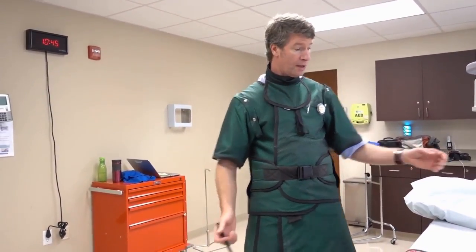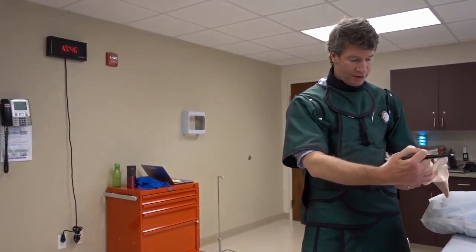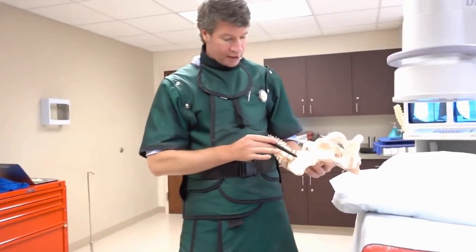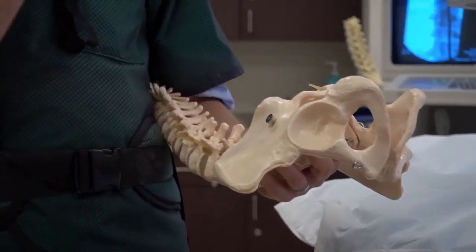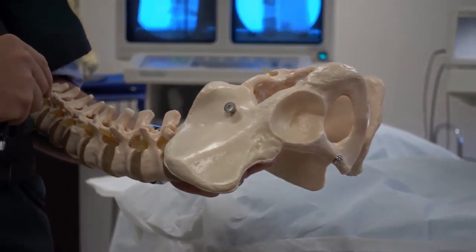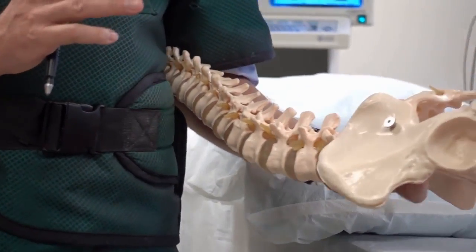Transforaminal just literally means through the foramen. The foramen is the hole on the side of the spine where the nerve comes out. And that's what we call it, the foramen. Foramen literally means window, if I didn't say that. So what's going in and out of the foramen? Well, we've got the nerve, the segmental nerve, okay, the spinal nerve. But often we have some veins going in and out. Occasionally we'll have an artery. There's one artery in particular that we're trying to avoid.